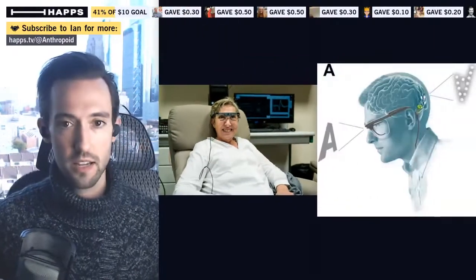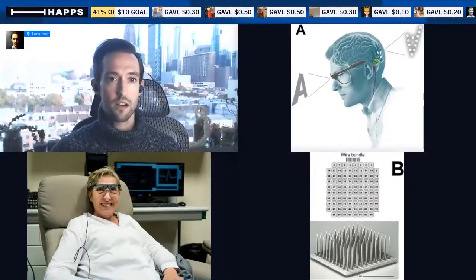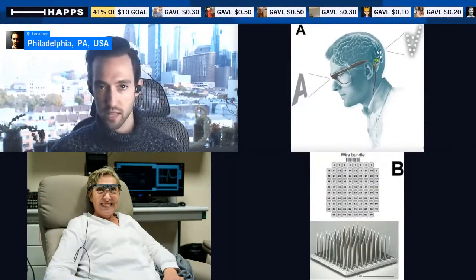So that's her wearing the whole preliminary, beta-level device, right? Which basically just looks like some sort of futuristic glasses. And they obviously have a bit of extra equipment going on beyond just some special lenses. But here is what that device really looks like. Okay. And so the glasses have a camera right in the middle of the bridge of the glasses. And then that fancy camera sends information to a device that then processes the images through some filters, processing the video essentially. And all of that ultimately ends up at their electrode array, which is the actual meat and potatoes of the device.